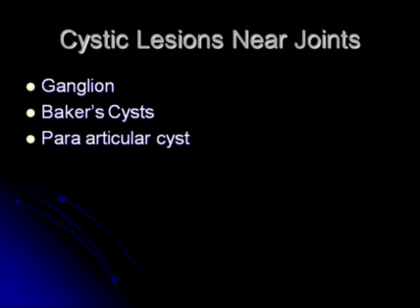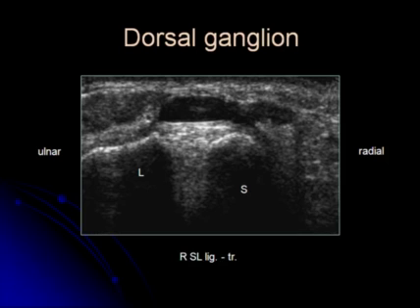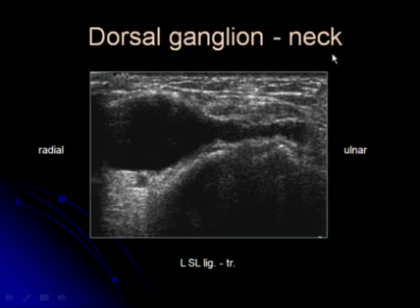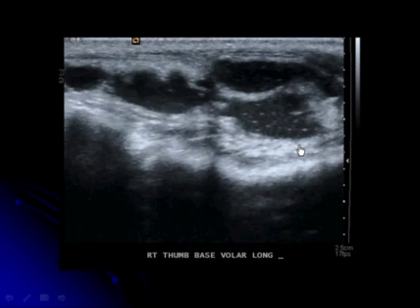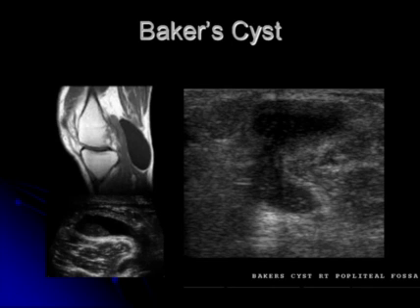Ultrasound is very good at looking at cystic lesions near joints. A few examples include looking at a ganglion cyst, a Baker's cyst, and a paraarticular cyst. Here is an example of a ganglion cyst at the scapholunate joint — a large cyst on the radial aspect with a neck leading towards the scapholunate ligament. This is a complex, multi-septated ganglion cyst. Here is an example of a Baker's cyst in the popliteal fossa.